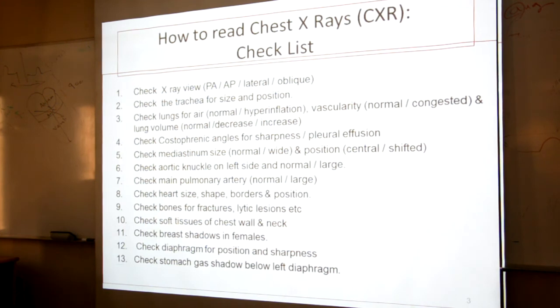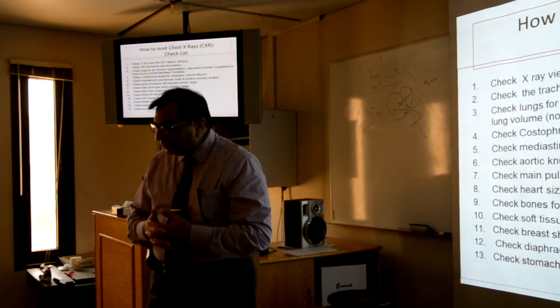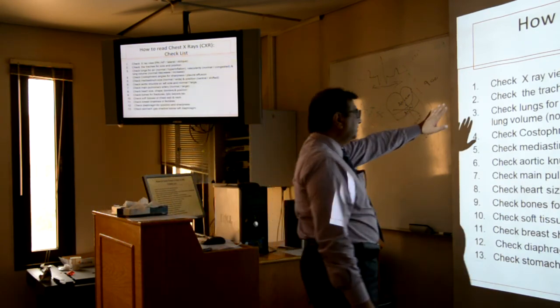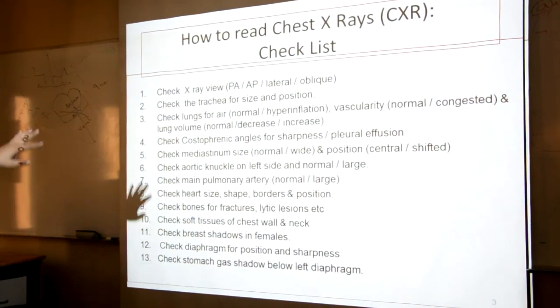Remember, what we are learning today is how to read the chest X-ray. Practically speaking, when a patient comes to you, when you are sitting in a clinic, or in an exam for clinical solicitation, you have to go through these checklists. This is the suggested list. In this order you can go, but there is no authenticated order. You can start from anywhere. But if you go in an organized way, there are less chances you miss the things.